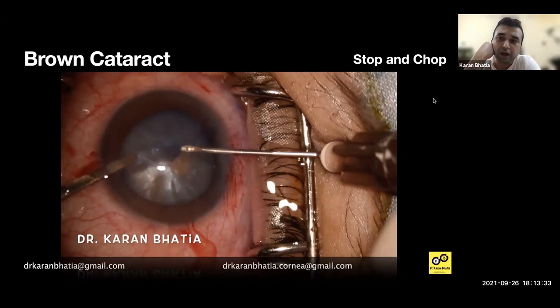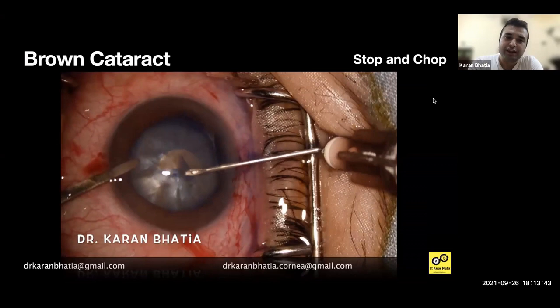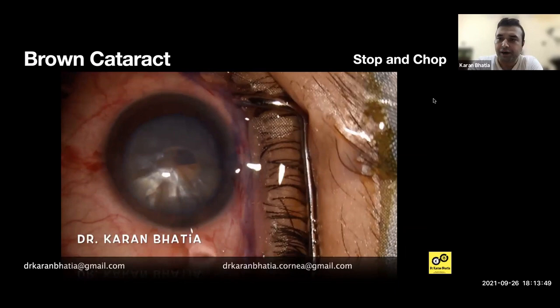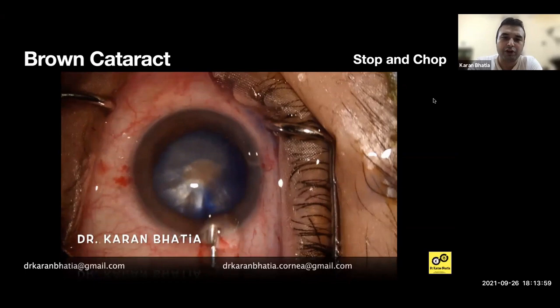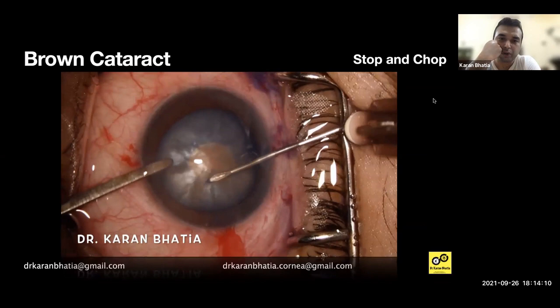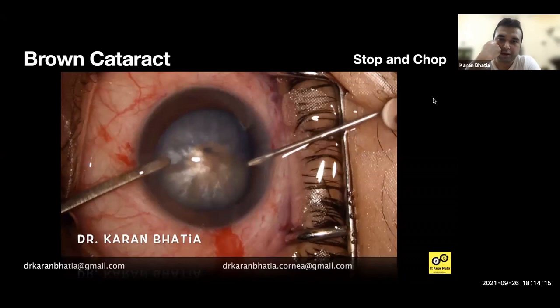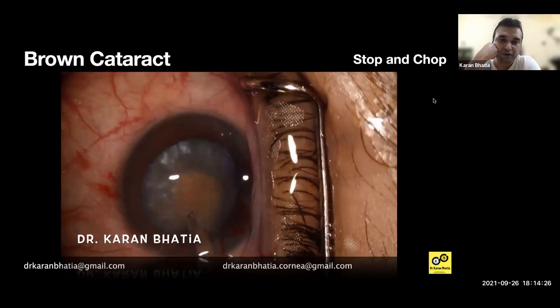I'm making a slightly smaller rhexis right now because this can easily extend to the periphery. These are mostly unedited videos with minimal editing. You can use a Utrata forceps or a micro-access forceps, whatever is available. Sometimes you need to change your incisions. After this is done, there is some matter there which creates chances of extension — I'll be discussing complications later. You can use a Simco cannula, bi-manual irrigation-aspiration — whatever you're comfortable with. Be careful not to touch the iris too much or the pupil will constrict.